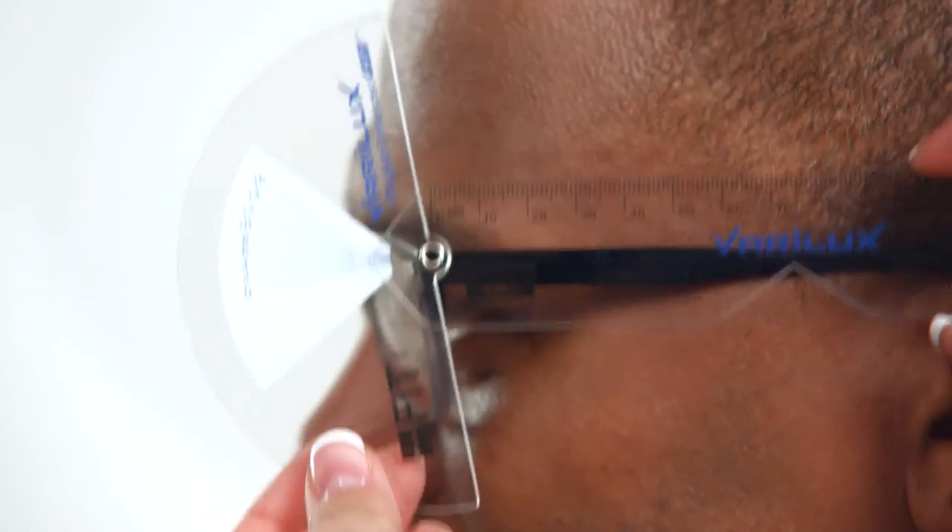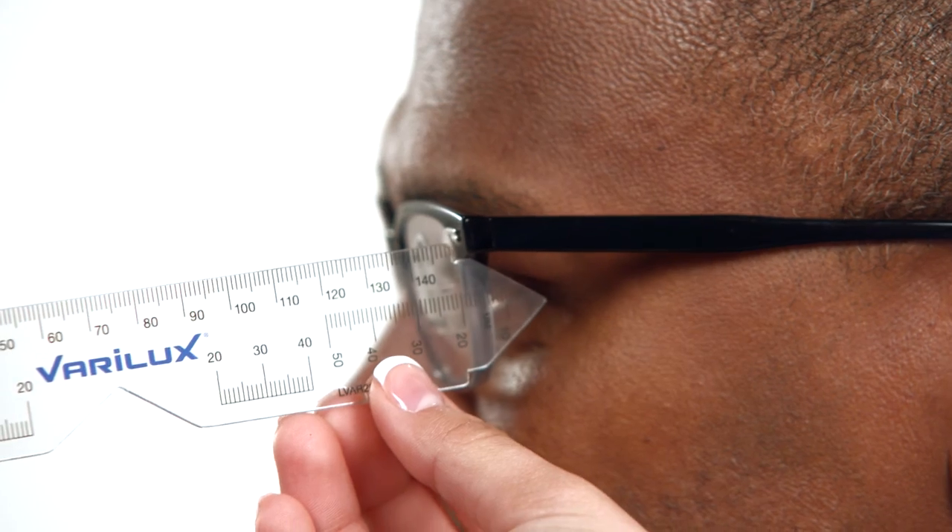If the lenses you ordered incorporate personalized measurements like pantoscopic tilt, vertex distance, and wrap angle, be sure to recheck these measurements.